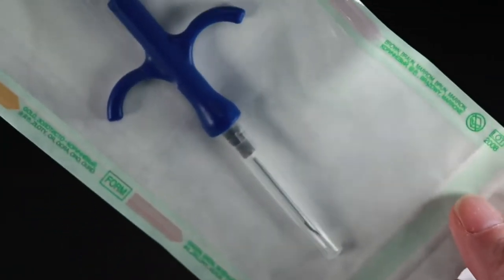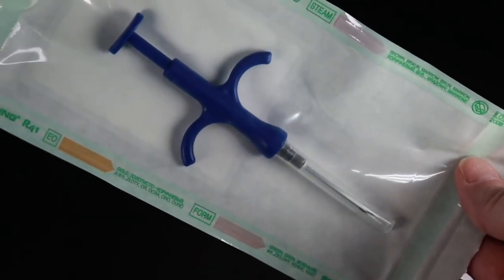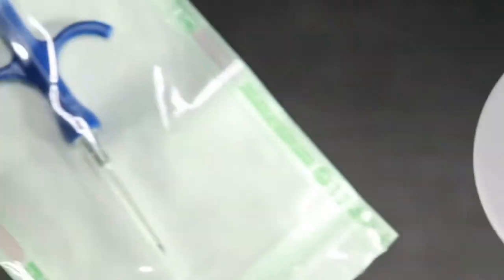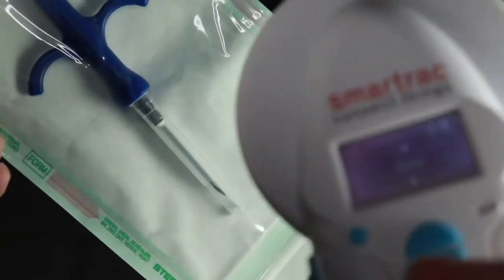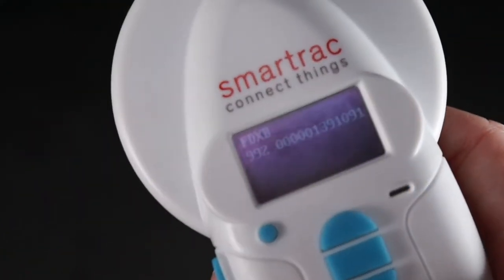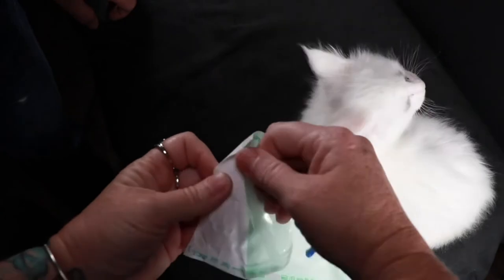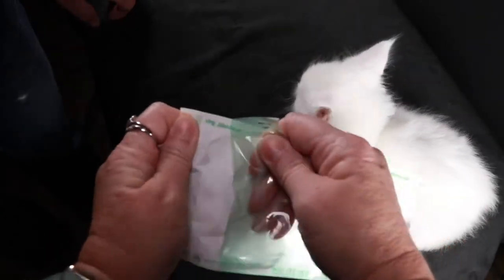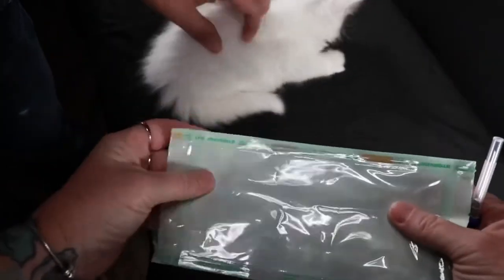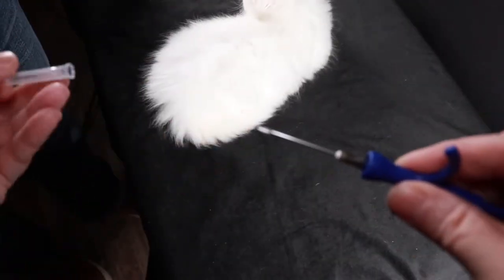If I turn the package over you can see that the microchip is sterile and sealed inside the packaging. I'm going to scan the microchip to make sure that it's actually reading the microchip number. I'm going to open and take the microchip out of the packaging and just take the lid off.